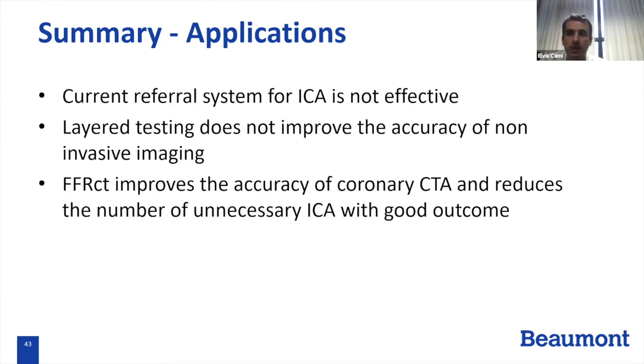In the past, we used to do a flash study on all of our pulmonary veins. Before AFib ablation, our EP guys get a pulmonary vein CT, and we used to flash those patients. That way it was easy, it was quick, and radiation dose wasn't that high. But we also do a full coronary read on those patients, and those patients get nitro as well.